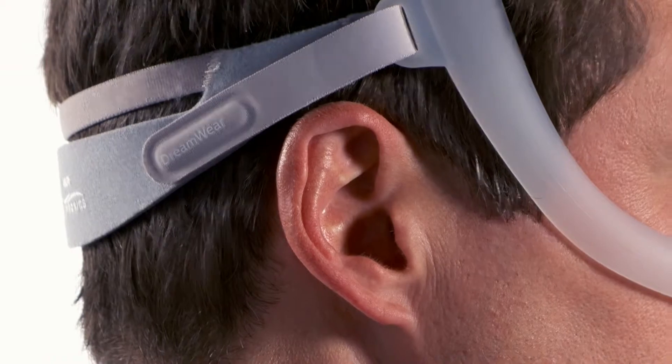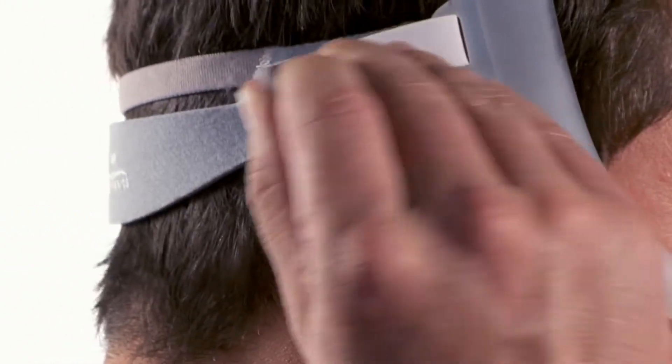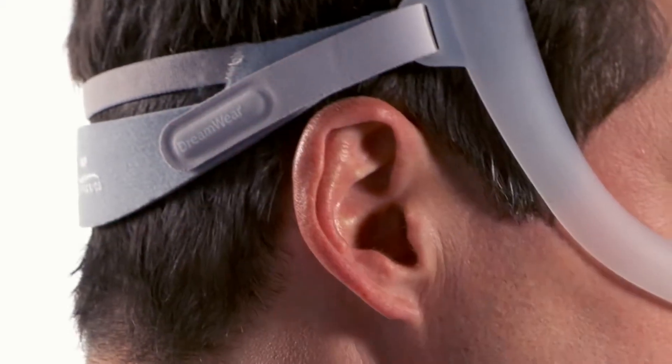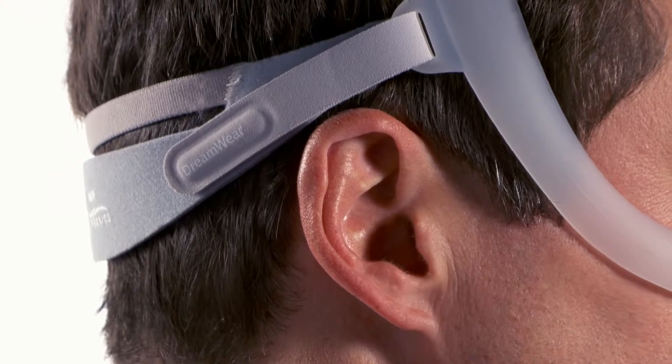Peel the headgear tabs away from the fabric. Adjust the length of the straps evenly to achieve a loose, comfortable fit. Press the tabs back against the fabric to reattach. Do not over-tighten.